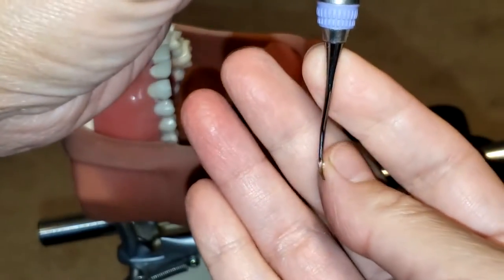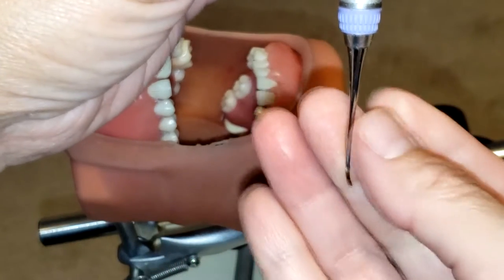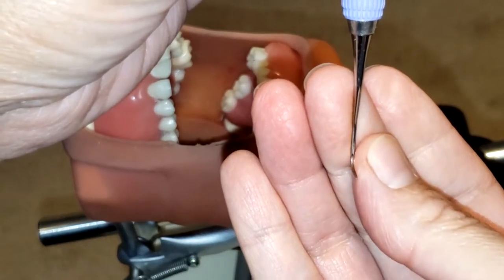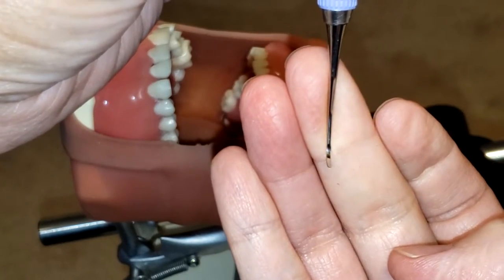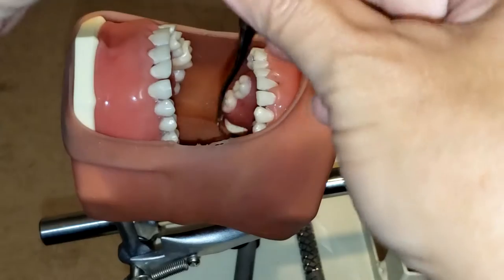If you take a closer look, you can see that the face tilts at a 70-degree angle to the lower shank, and that is your cutting edge.